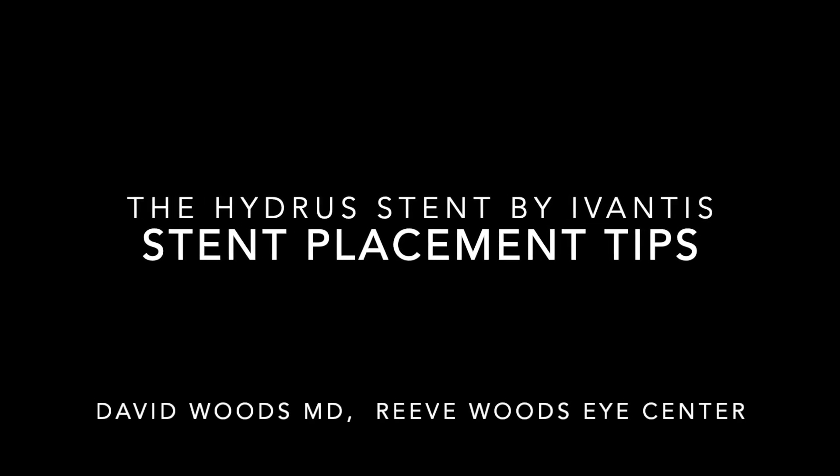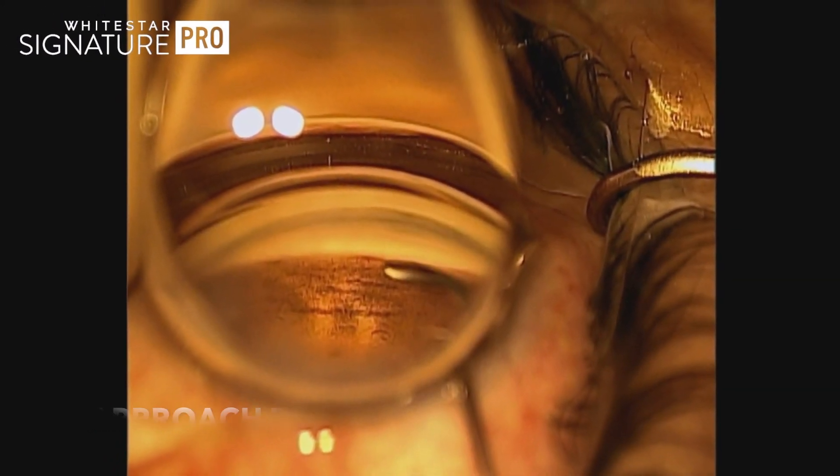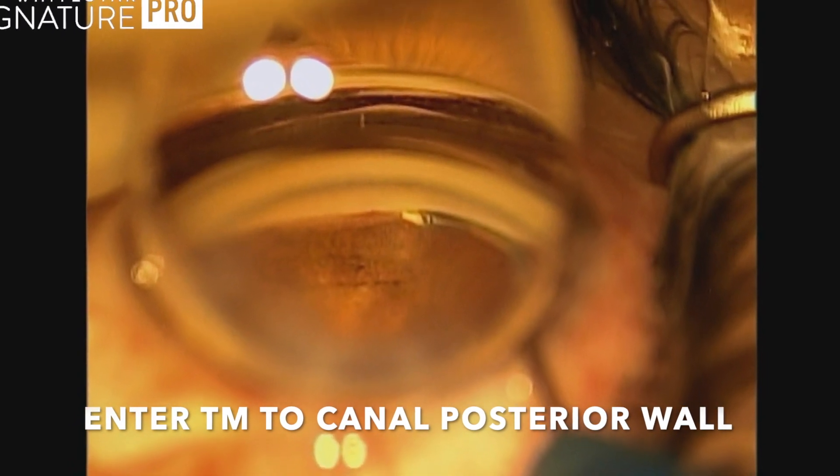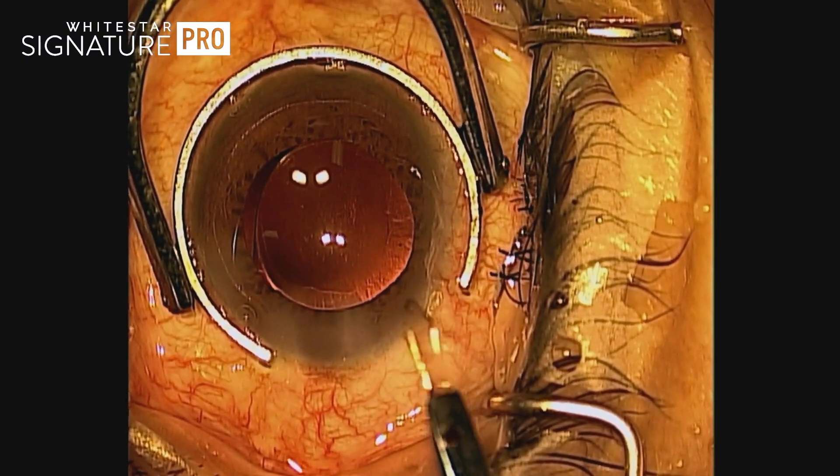Welcome everybody. We're going to talk about the Hydrus stent today and some of the techniques used to make this a routine procedure. Here you can see the trabecular meshwork and the Hydrus stent approaching it, engaging the canal and pushing up against it. After having released the Hydrus, you can see the stent in the canal.